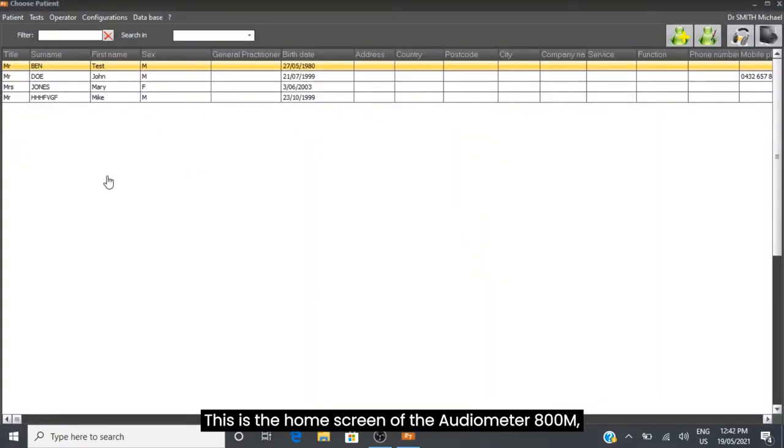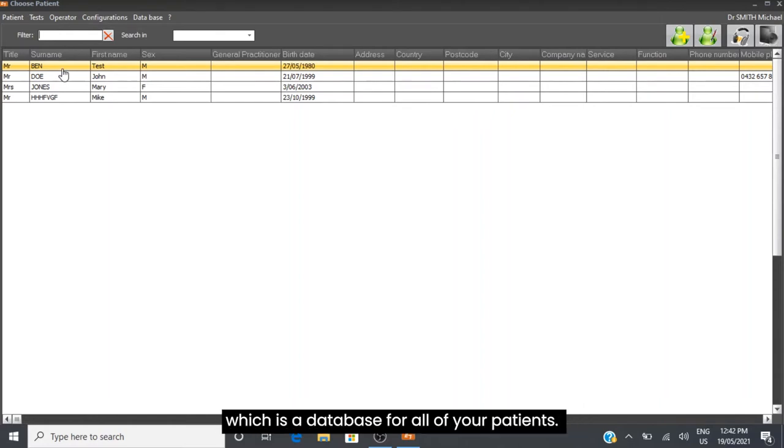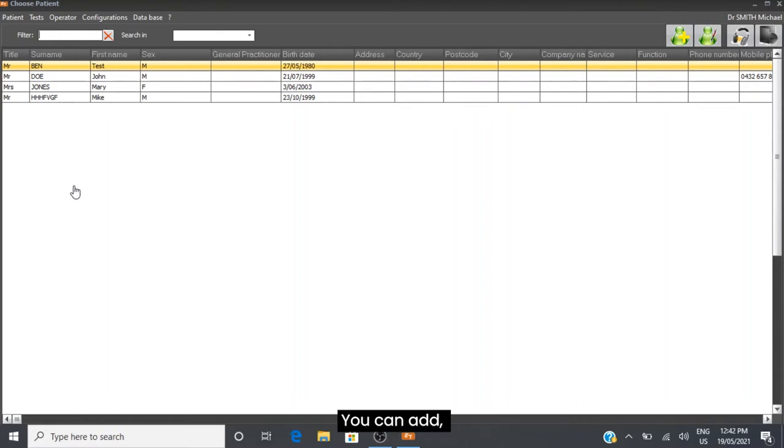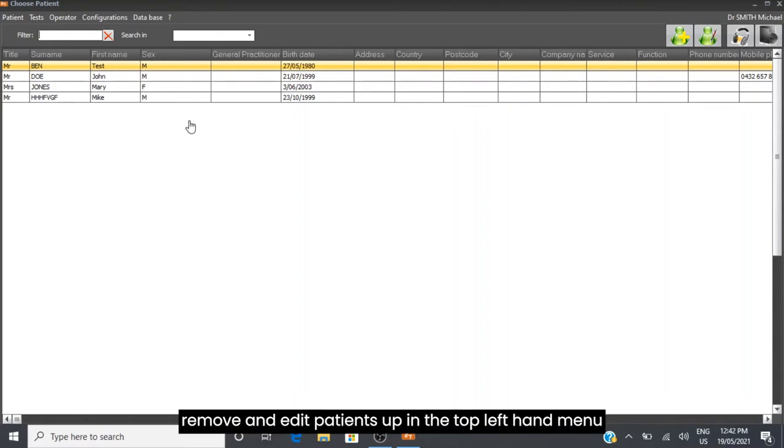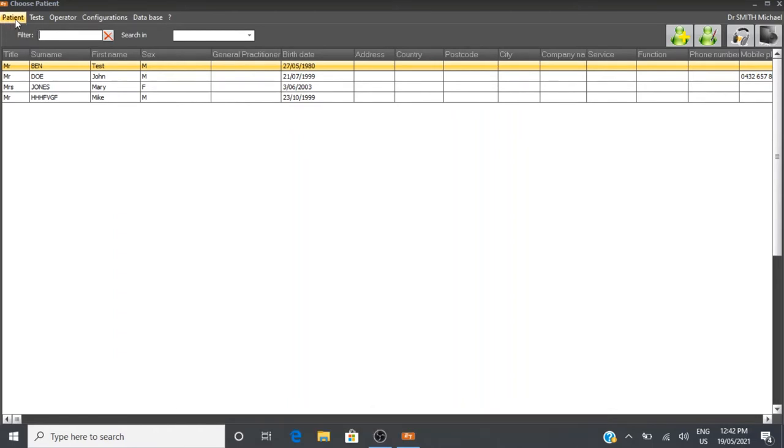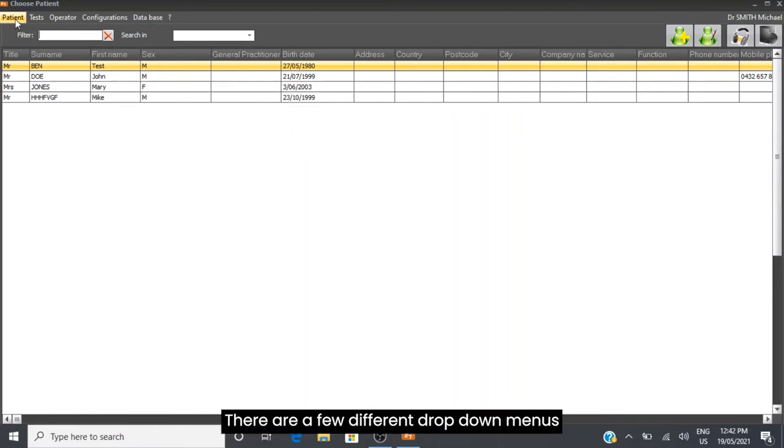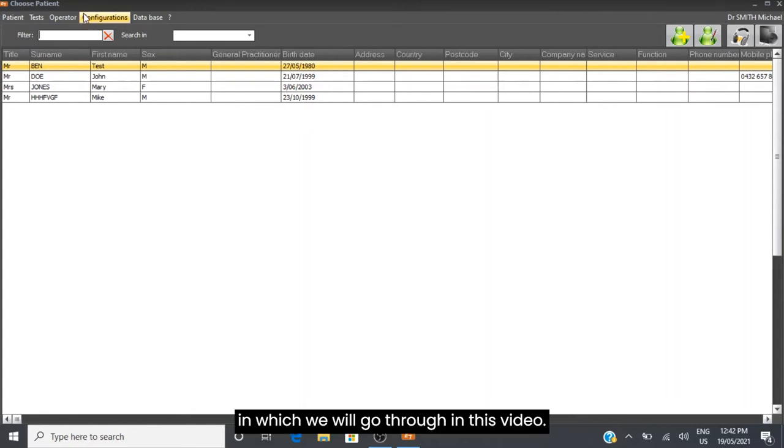This is the home screen of the Audiometer 800M, which is a database for all of your patients. You can add, remove, and edit patients in the top left hand menu. There are a few different drop down menus which we will go through in this video.